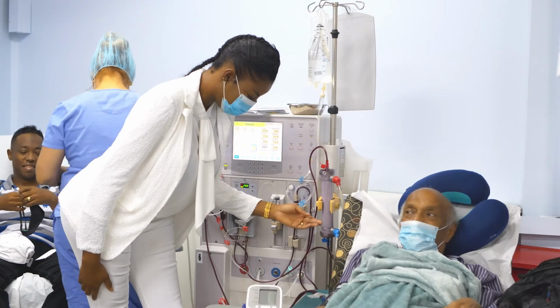So for how many hours? 4 hours, 6 hours? How many hours exactly for hemodialysis? The nocturnal dialysis goes for about 6 to 8 hours. Everything slows down. Pump speed slows down, gentler on the body.